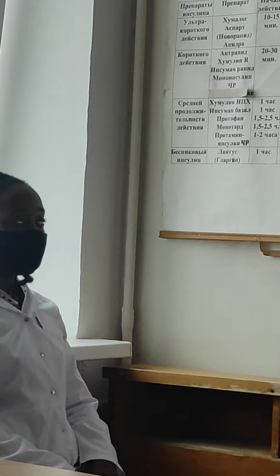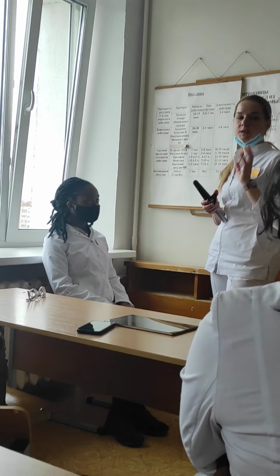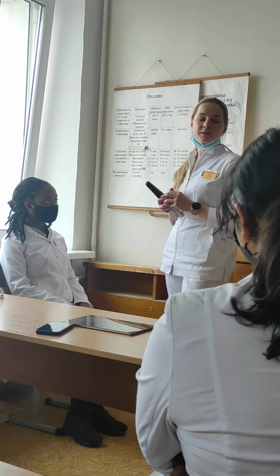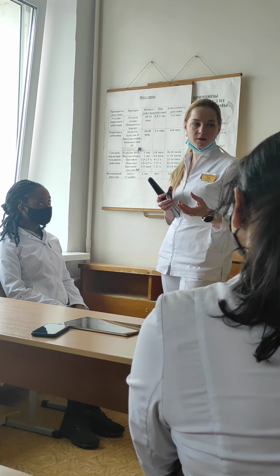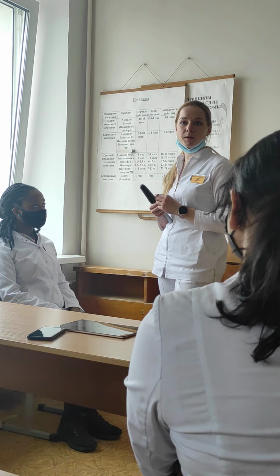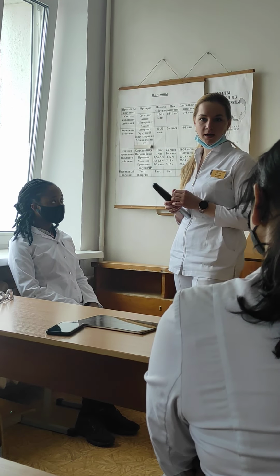So after that, we can make the conclusion of checking the eye fundus. What do we need to describe? We need to describe everything we saw. First, we need to describe the optic nerve. We can say that it's light pink in color, has sharp margins, and is surrounded by vessels. The vessels, arteries and veins, are normal in size and in the way they are directed. Also, we need to describe the retina: there are no pathologies in the retina. The macula has a good red reflex, and no dystrophies or any pathologies at the eye fundus were seen.